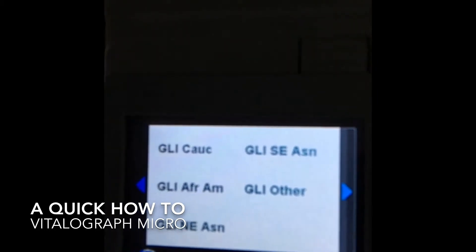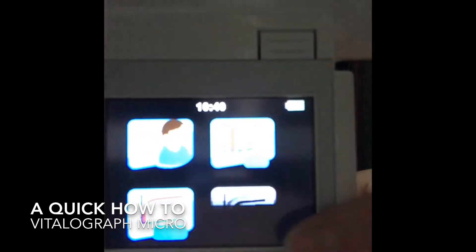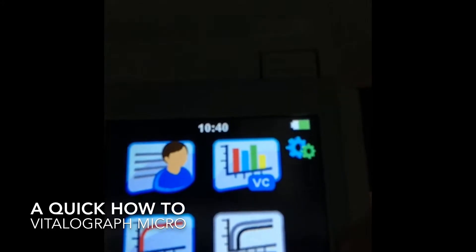So once your predicted calculation has been set, then you simply push the green button and enter, enter, enter, all the way back to our home screen, and now we are ready to test.